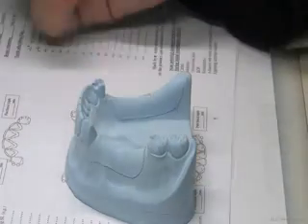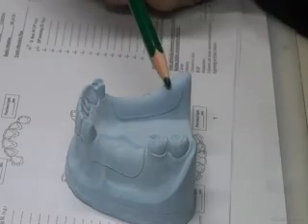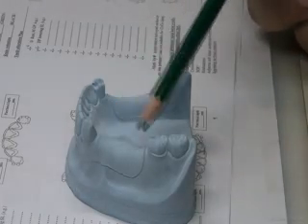For educational purposes, we made you deal with an open lattice to see it and really feel it and look at it and really understand how thick it is. On the other side, you used the mesh, and now you know what a mesh actually is. So we changed this design here just for educational purposes.